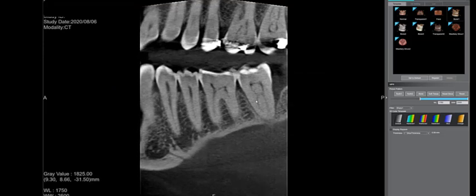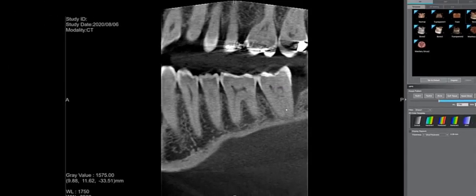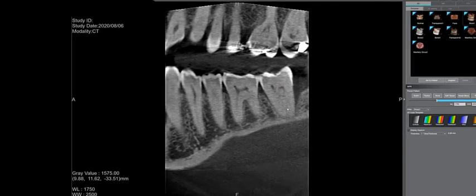And if we kind of, right there, I don't know if you can see that horizontal fracture line. Oh, yeah. Okay. Yes. And so the bane of endodontics is the vertical root fracture, or the root fracture that you can't see. So you just keep throwing things at the tooth. Yeah. Hope that something works. And then when nothing works, you diagnose a root fracture, because what else is there? You've tried everything else. Yeah.